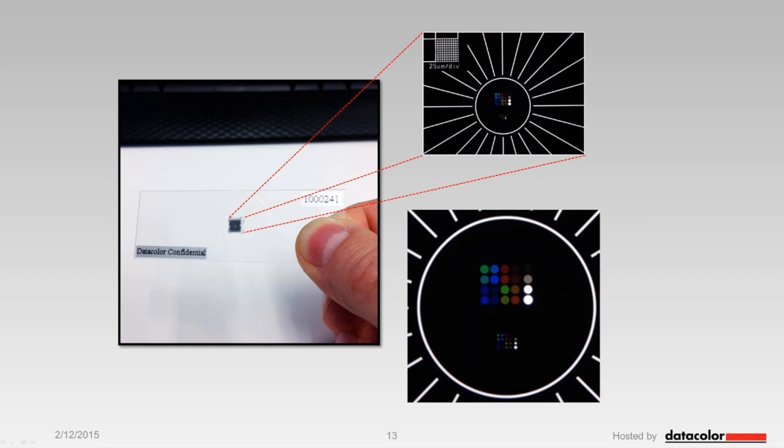And you see it more clearly in this close-up. So this is used for the color calibration, those 4x4 colored dots. And the imaging system test is actually done with those 4 dots on the right-hand side. So this is the diagnostic feature, and this is the color calibration feature. Just to prevent any misunderstandings, I'm only talking about the diagnostic feature, which is provided by the right-hand side dots.